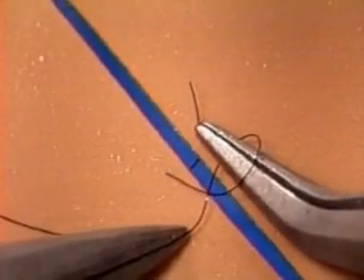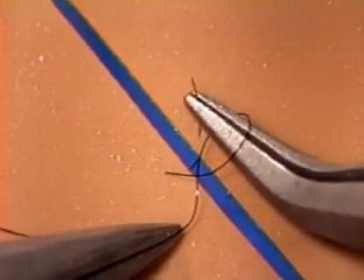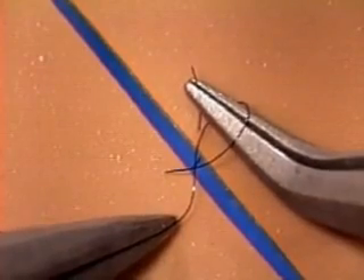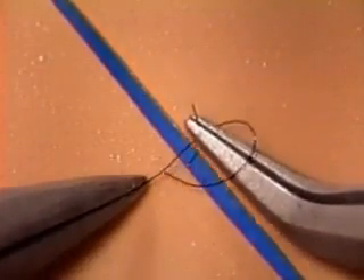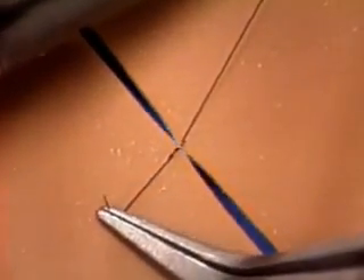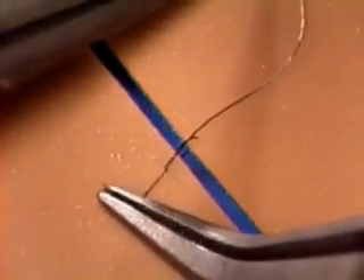That's it for act two. For act three — picking up the short end — provided the tip of your forceps is pointing in the right direction, there's nothing to it. Just pick up the thread and move straight on to act four: pulling the short end through the loop. Pull the short end across the wound in one direction and pull the loop length across it in the other direction, and your half knot is complete.